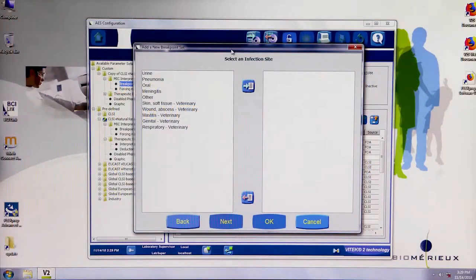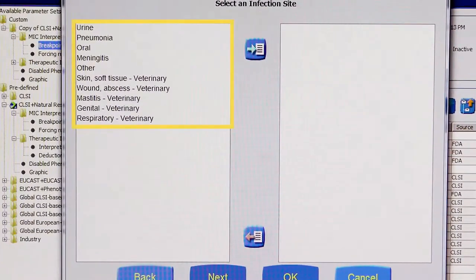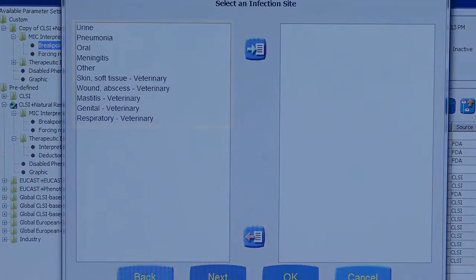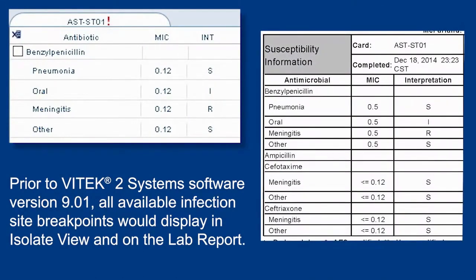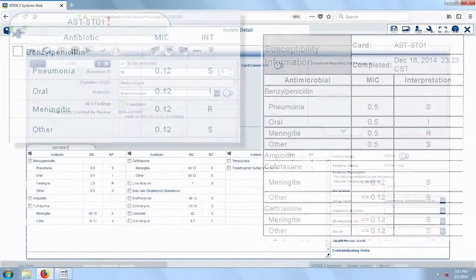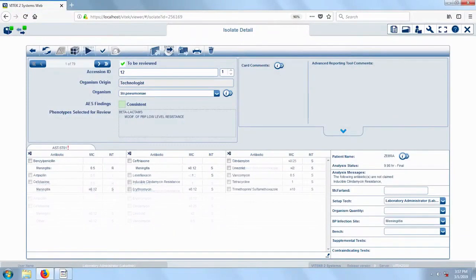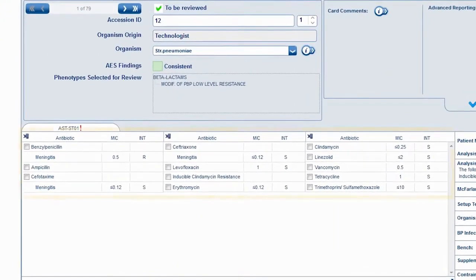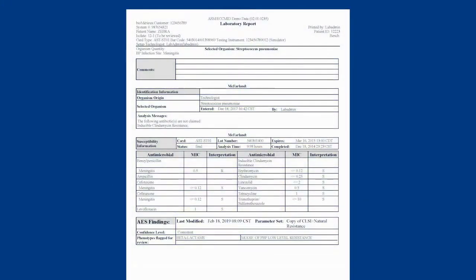All users, clinical or veterinary, will see the complete list of infection sites when defining a breakpoint or working with an isolate. Prior to Vitec2 system software version 9.01, all available infection site breakpoints would display in isolate view and on the lab report. Now it is possible to refine the results to display only the breakpoints associated with the infection site in worklist view and on the lab report.